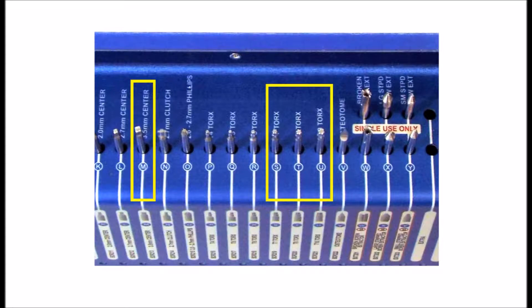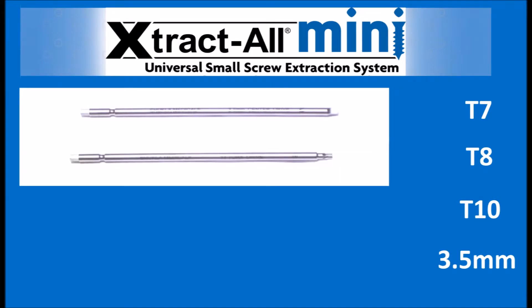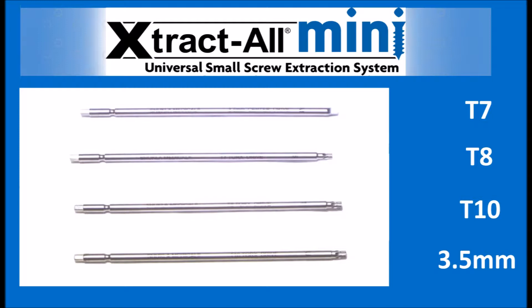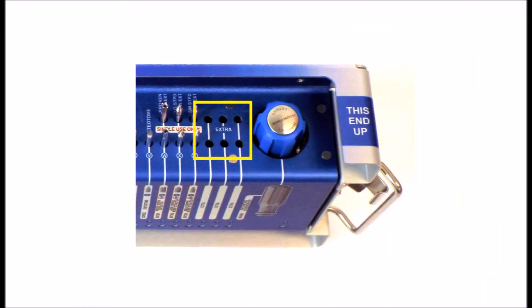We added Torx driver sizes T7, T8, and T10, along with the 3.5mm center driver. To the right of the tray are now six extra slots, which are ideal for adding other specialty drivers.